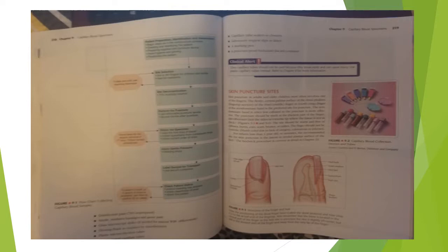Disinfectant pads, 70% isopropanol, sterile non-latex bandages and gauze pads, glass microscopic slides if needed for manual WBC differentials. Diluting fluids are as required by manufacturers. Plastic micro collection tubes, plastic coated capillary tube seals or closures, laboratory request slips or labels, a marking pen, a puncture-proof biohazard discard container.